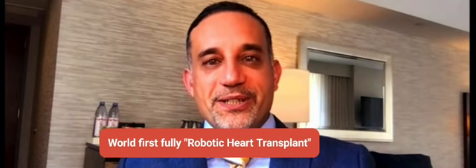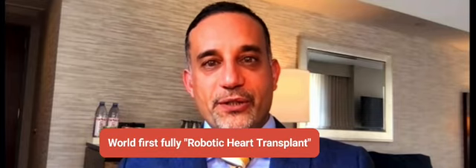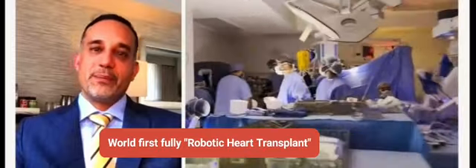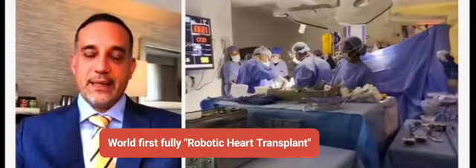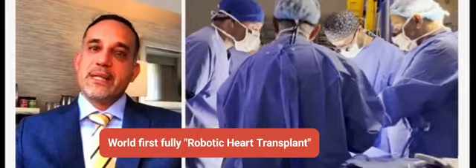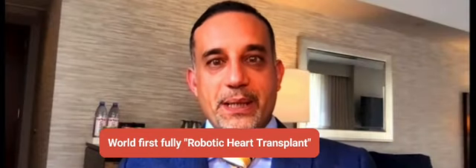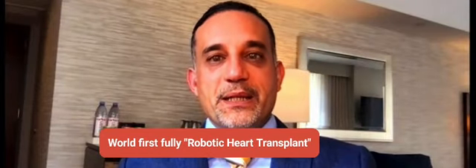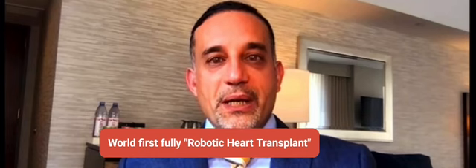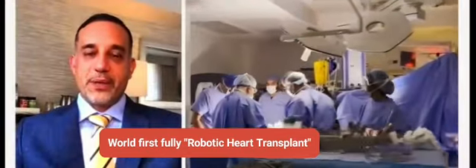Just to answer this question, it is rather delicate, but after having above 400 cardiac surgical procedures, we did develop the know-how to handle these organs delicately, especially when we conduct robotic coronary artery bypass, where you deal with less than a millimeter in diameter of vessel and lumen, and threads are not seen by the bare eye. So honestly, especially with something such as a robotic heart transplant, it has to be practiced prior to conducting.